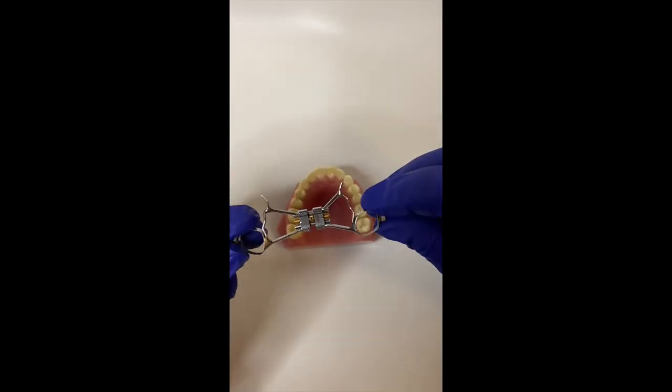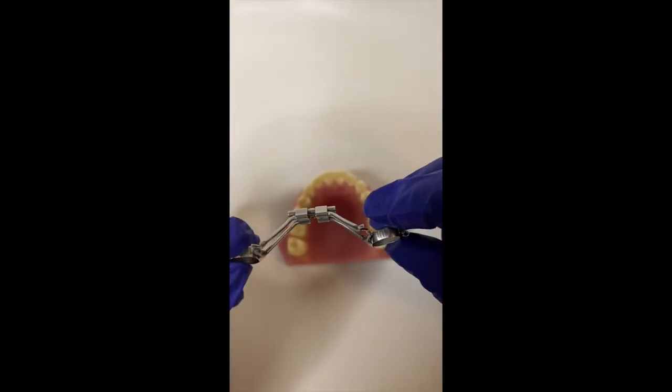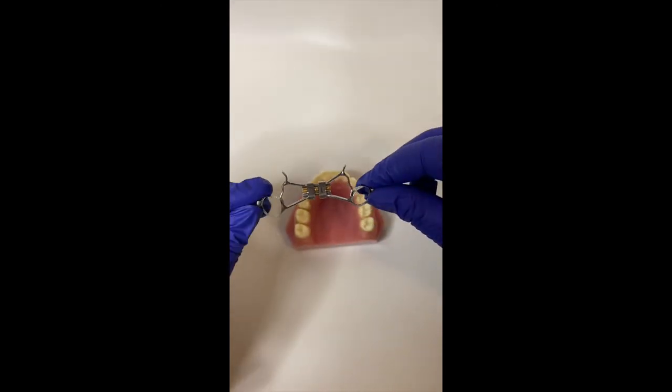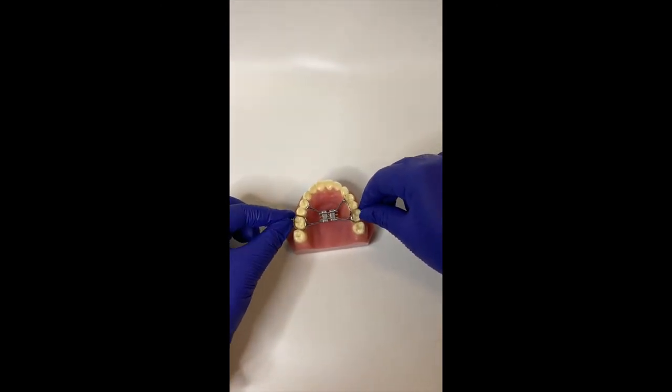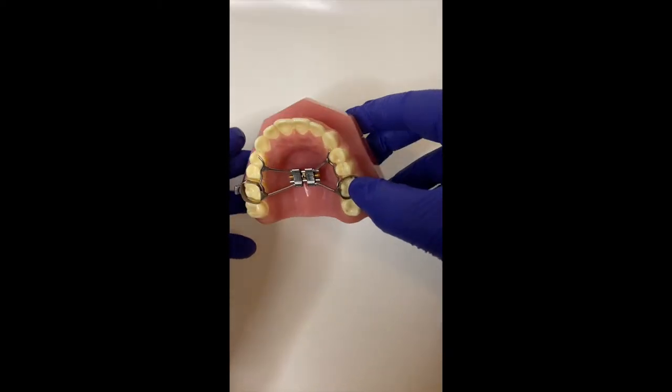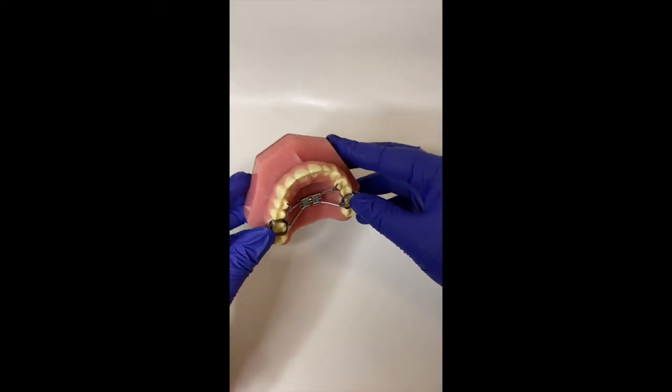At the delivery of the palatal expander, we will be adding some blue cement around the bands and cementing the palatal expander into place. Once the palatal expander is cemented, we will be going over home care instructions as well as how the palatal expander works.